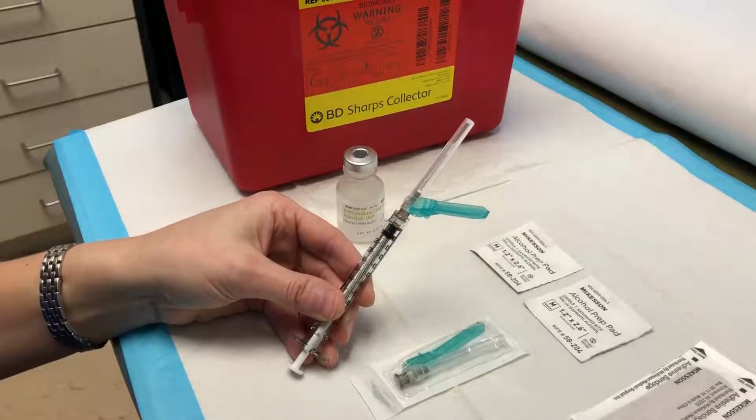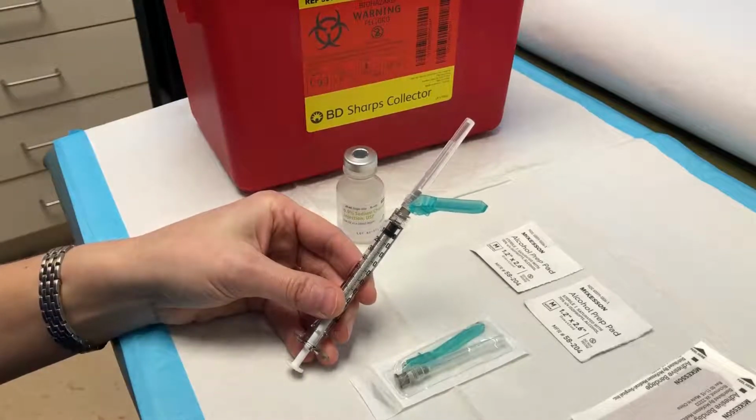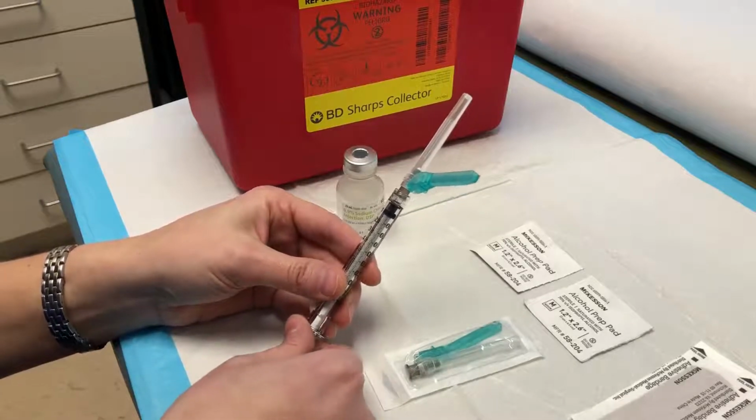Draw air into the syringe that is equal to your dose of medication. By putting air from your syringe into your vial, you help maintain the pressure in the vial, making it easier to draw up your medication in the future. So for example, today we'll be drawing 0.2 mLs into the syringe, same as our dose.